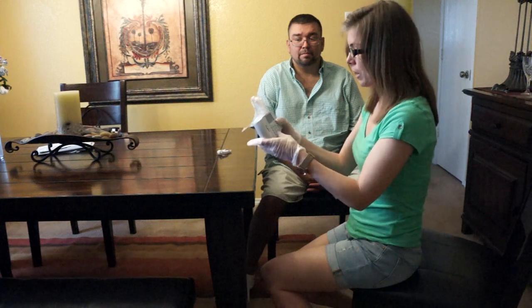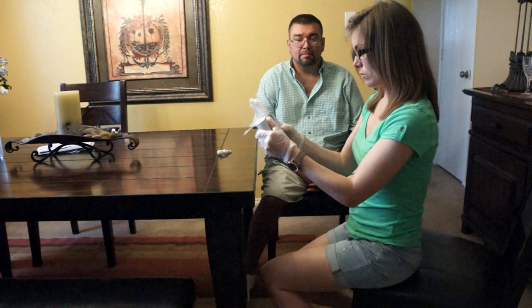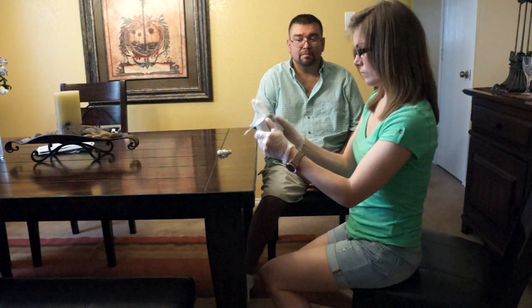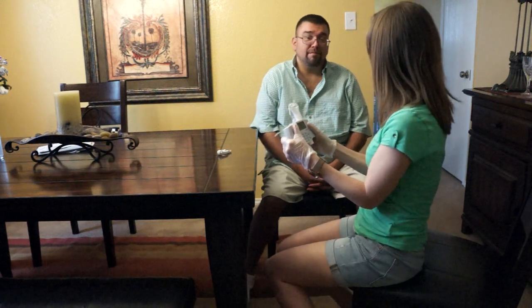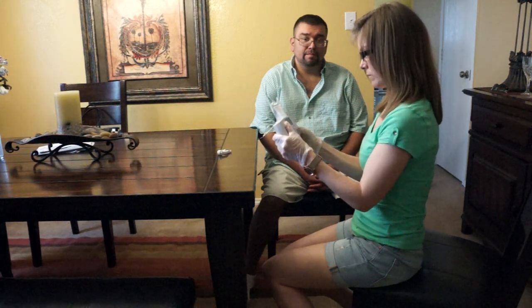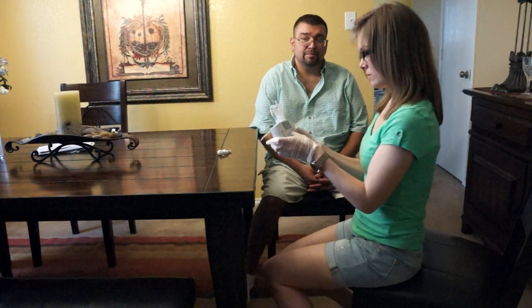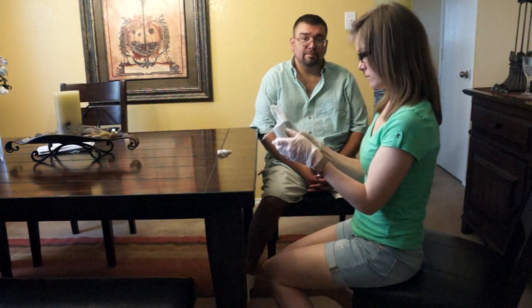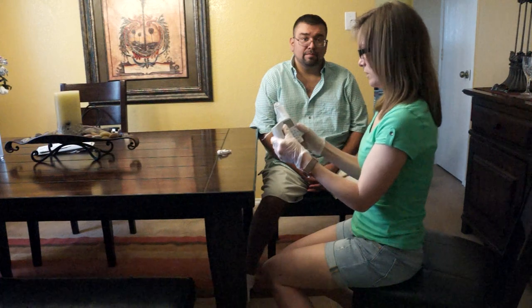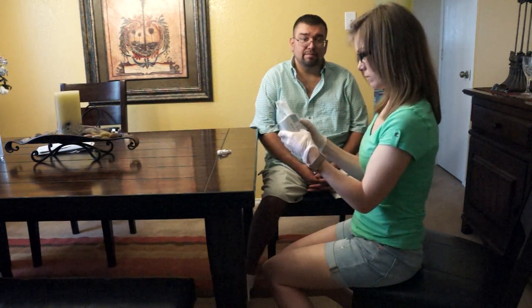Okay, so I'm going to put in an ID. And how old are you? I'm 44. And how tall are you? 6'2". And how much do you weigh? 270.